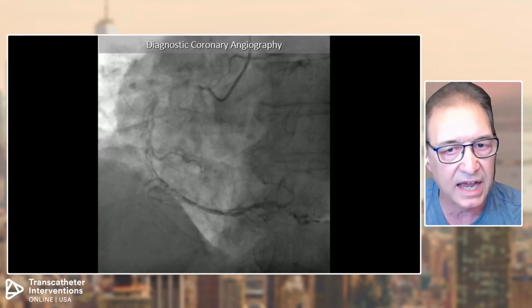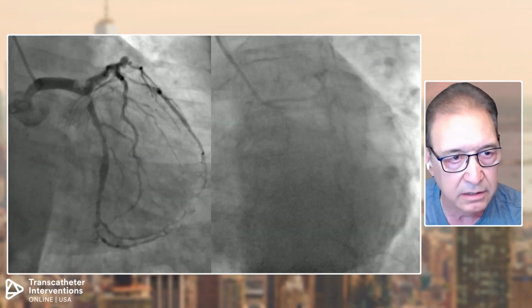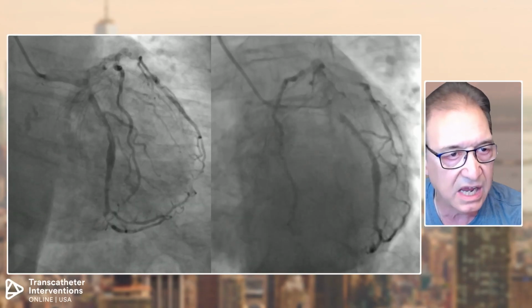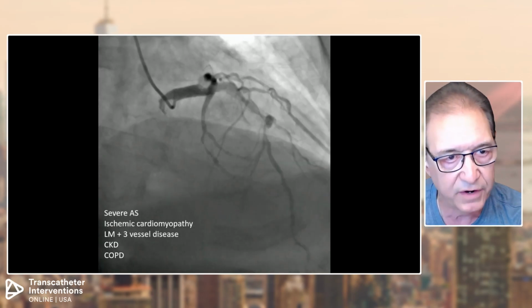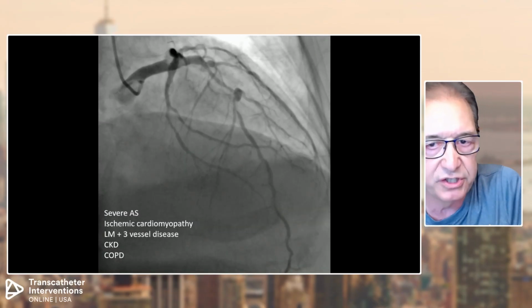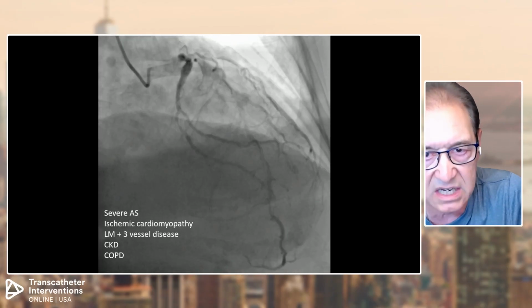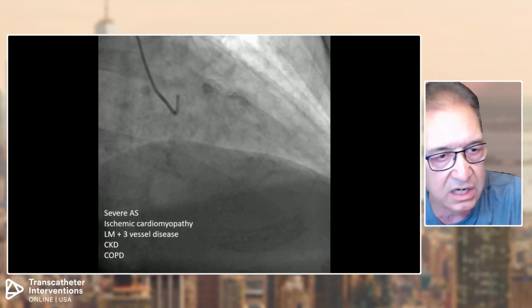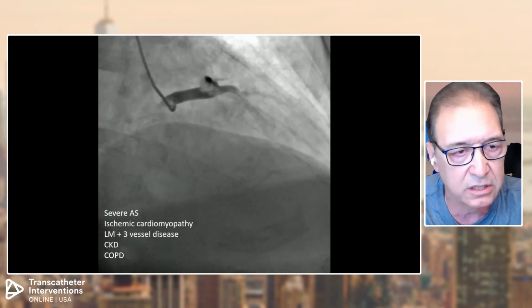And her diagnostic angiogram shows high-grade disease in the right coronary artery. And then this really, really calcified mess in the left main extending into the LAD and the left main extending into the left circumflex. No question about the severity of disease. And you can see these calcium boulders in the proximal vessels, but you see, and I think Ziad set me up perfectly, you see calcified disease extending down the LAD. And so this is going to need advanced therapy. And we felt that this needed advanced therapy proximate to valve therapy.